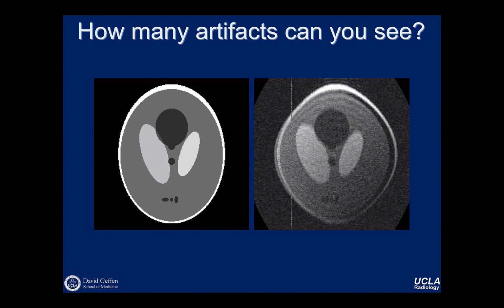They'll run the scanner so that nothing terrible happens, but it'll be up to you guys to figure out how to solve this problem, right? So we can do one right now, right? And so this image on the right-hand side has a bunch of different artifacts, right? Some are maybe easy to identify. I know what they are because I made them, right? This is a synthetic object, and I can manipulate the fields and do everything I want to make this composite image with several artifacts.